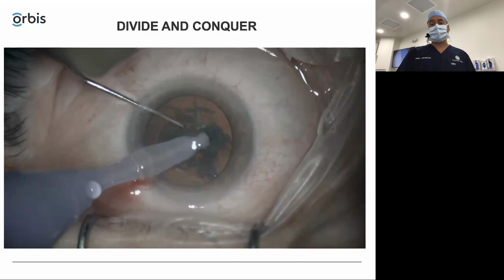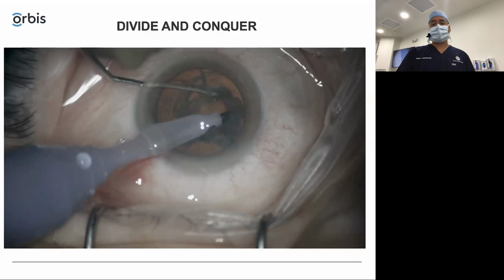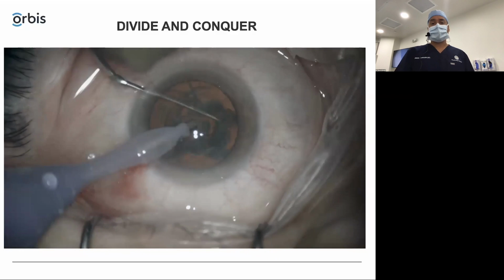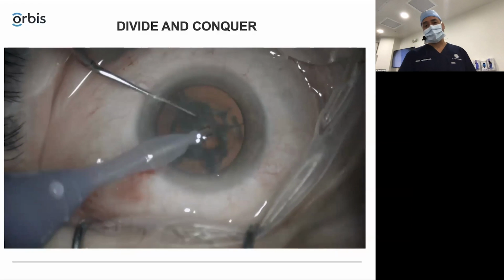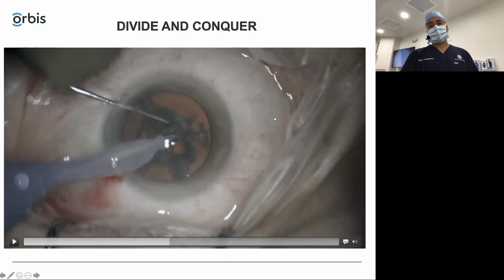Here I just extend that first area, the little groove that I'd made. And now we kind of just have this heminucleus there, and we're going to do the same thing that you kind of saw in the video. So you guys get the divide and conquer stuff.